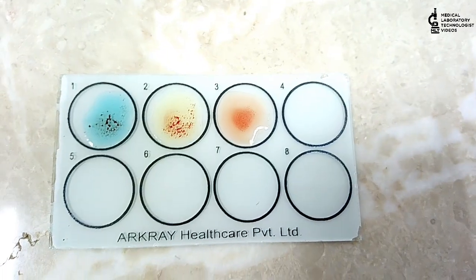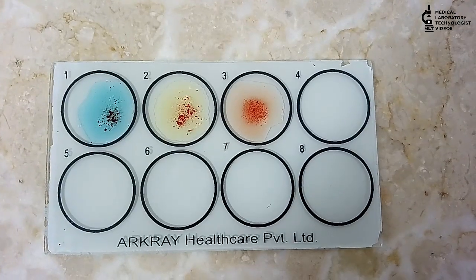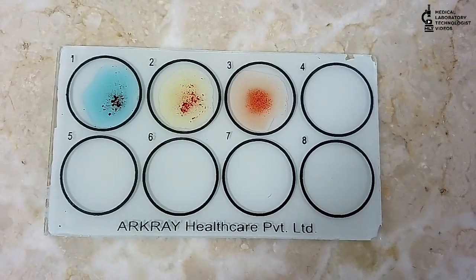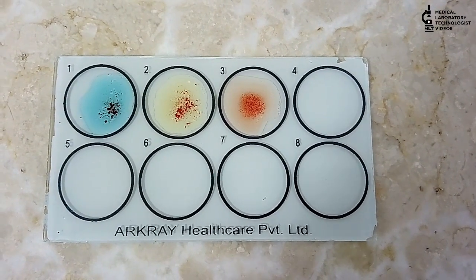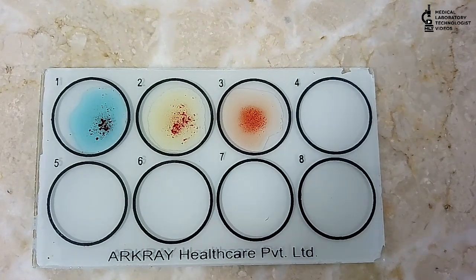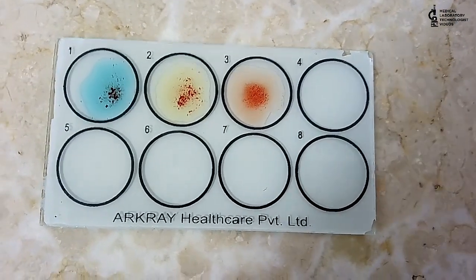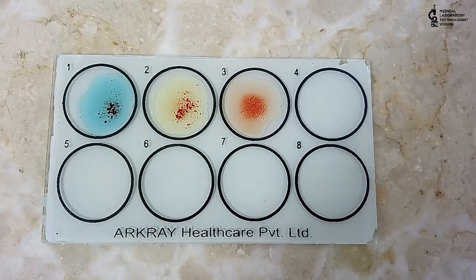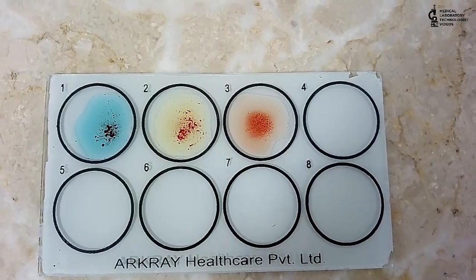By this video you can easily learn how to use blood group controls and, in the forward method, how to use blood group controls to check our seras. I hope you liked the video and found it easy to understand. I will meet you in the future with a new video. Until then, take care of yourself and be happy.